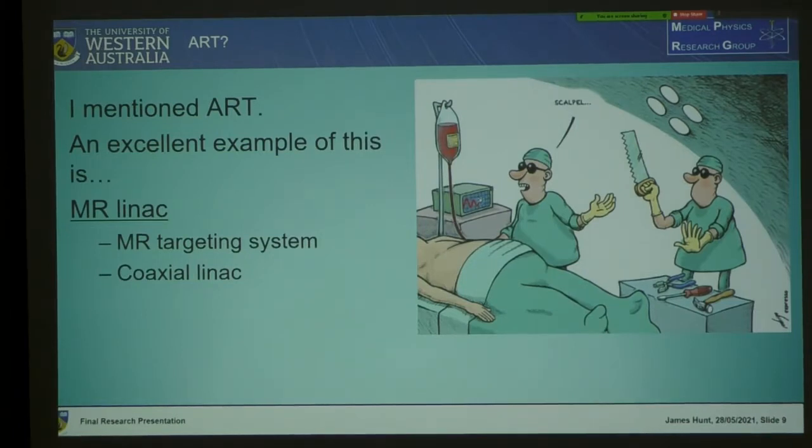That leads me to radiotherapy. If we have a CT beforehand, but then you're not able to see what's going on, you might think that's a bit like this situation. We're a lot better than that, but MR-linac is what I'm trying to get to. So MRI-guided radiotherapy, in particular using the Elekta Unity, has the ability to use MR imaging during treatment and during fraction delivery to get a really good view of what's going on. And generally it consists, I'll show you some images later, of a linear accelerator coaxial with an MRI imager.